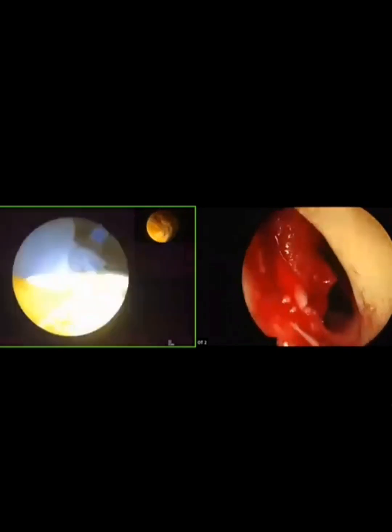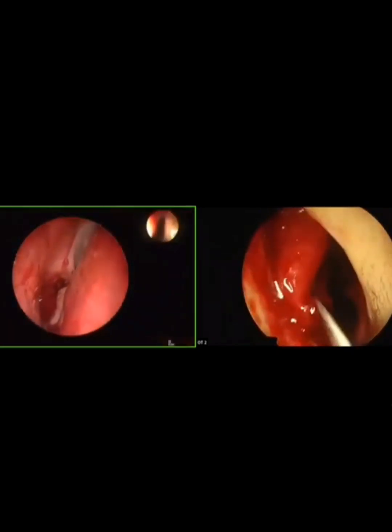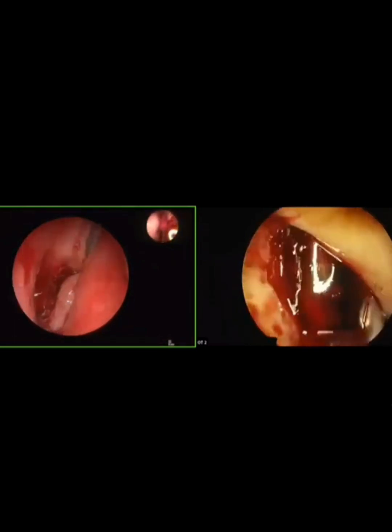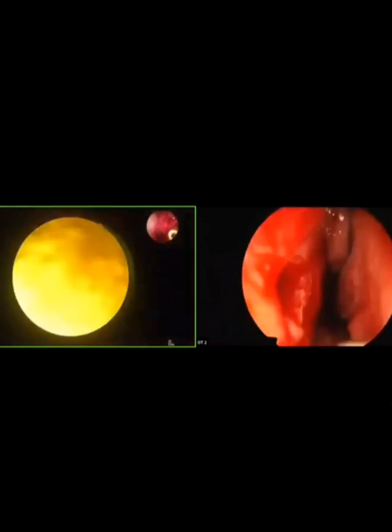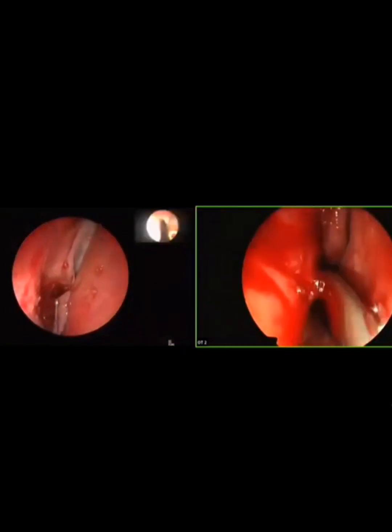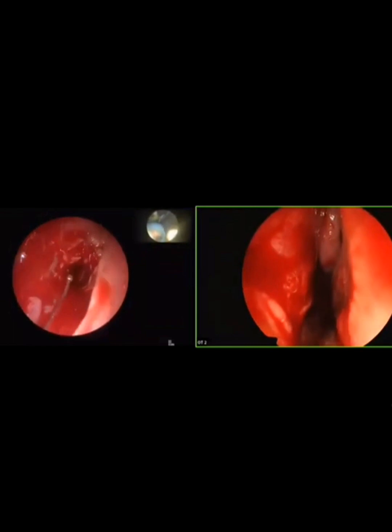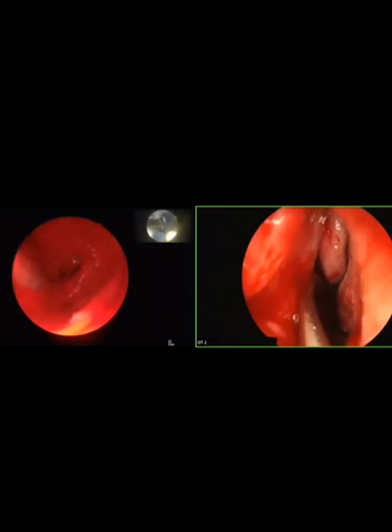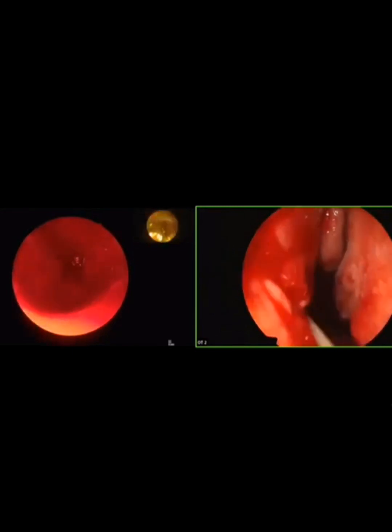Suction. No wash, please. No wash. Hello. Yes, ma'am. Achha, okay. Hello. For the auditorium. Yes.